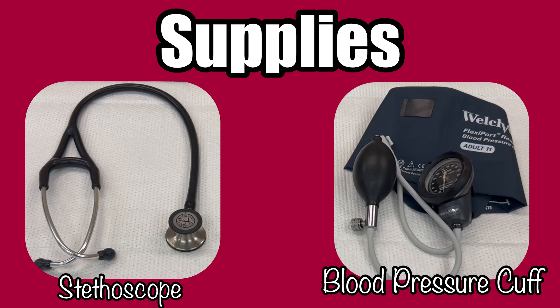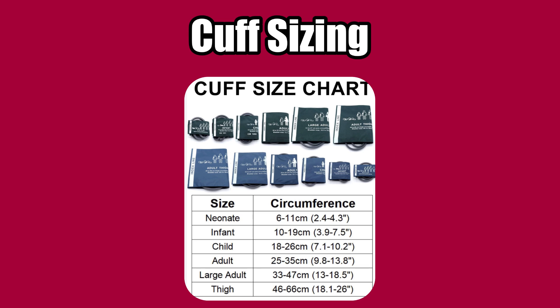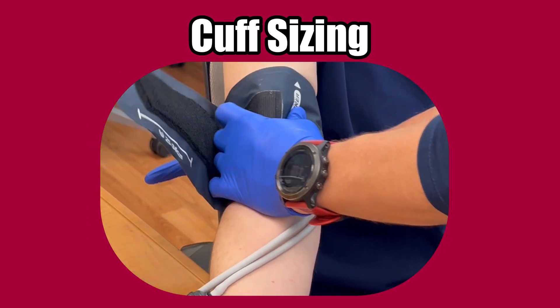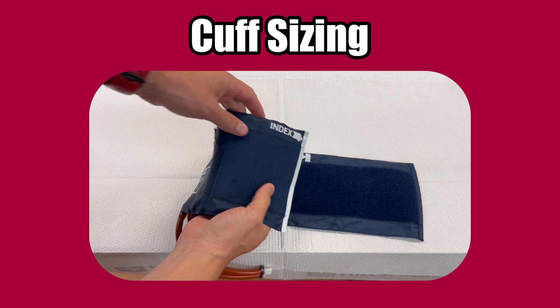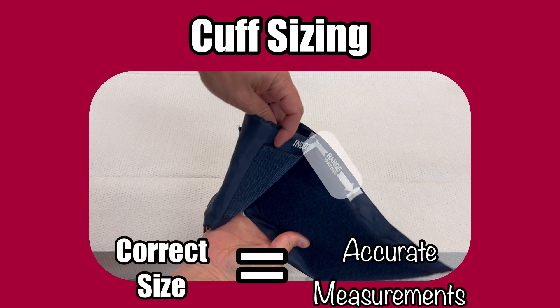You don't need any specific or special stethoscope, but you will need to choose the correct size cuff for your patient. There are tables that show you arm circumference related to cuff size, but that won't help most people at the bedside. Each cuff has a size range indicator. Go wrap the cuff around the patient's bicep and velcro the two sides together. If the end of the cuff — sometimes labeled as the index line — fits in between the size range when applied to the patient, the cuff is the correct size. If the index line is not within the range, the readings you will get will be inaccurate.